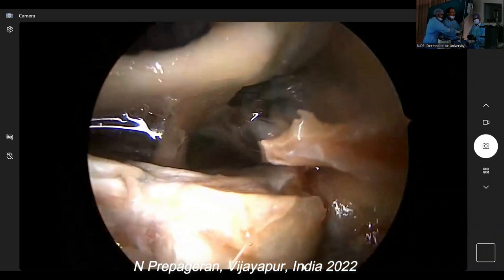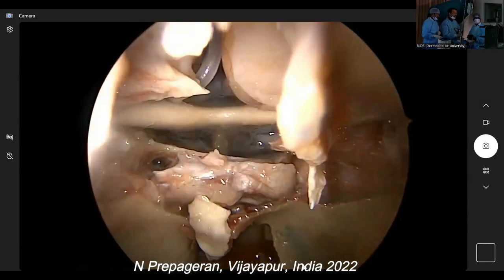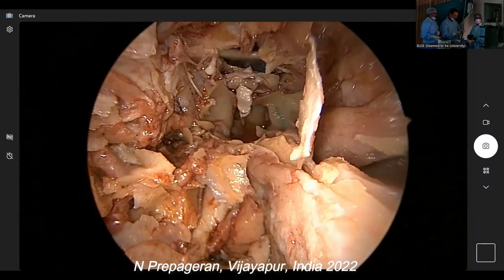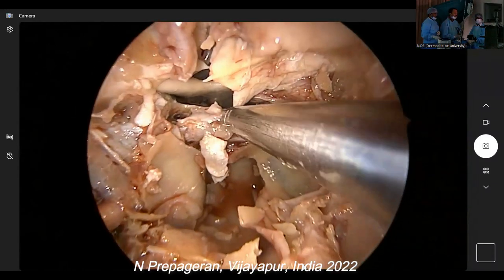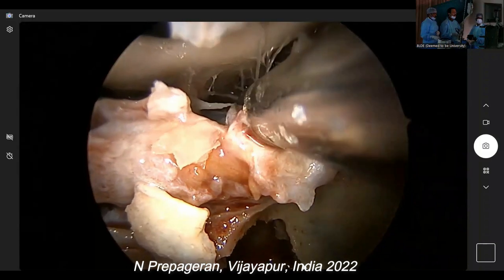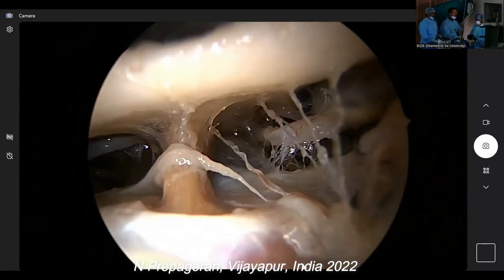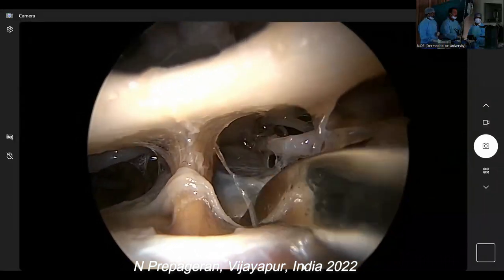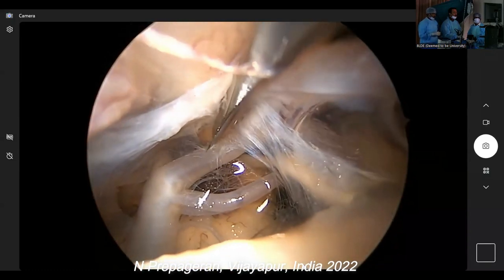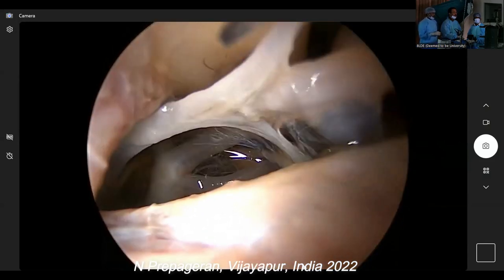Thank you. Can you put it in? Look at it, it might be easier for you. Okay, so now you can see the branch here. Membrane of Liliequist, I open this up. Basilar artery, posterior cerebral, superior cerebellar, third cranial nerve. So this is the membrane of Liliequist. Can you see? Beautifully seen here.